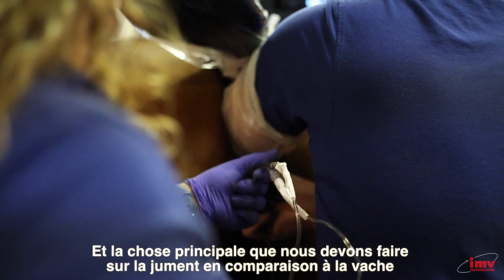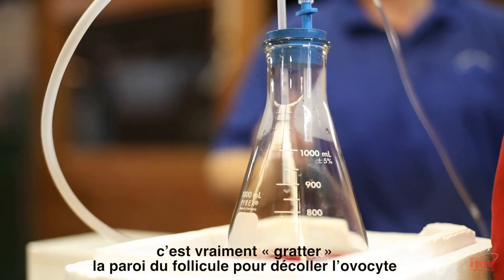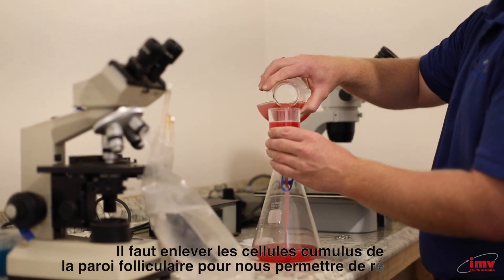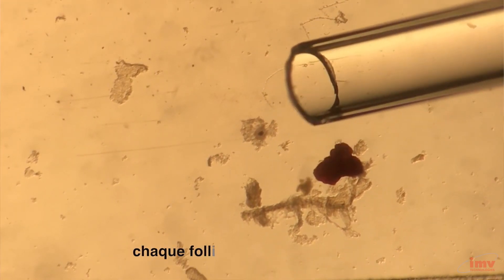The main thing that we need to do in the horse, as compared to cattle, is really scrape the wall of that follicle to remove the oocyte in its bed of cumulus cells away from the follicular wall and allow us to recover that individual oocyte.